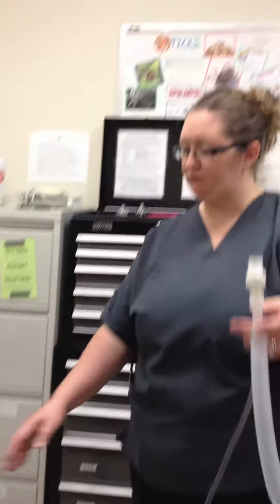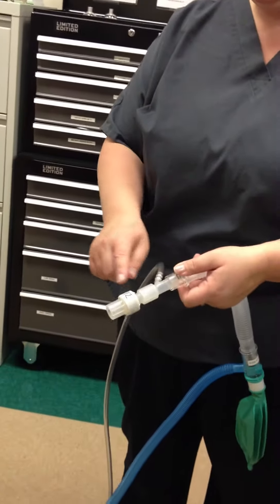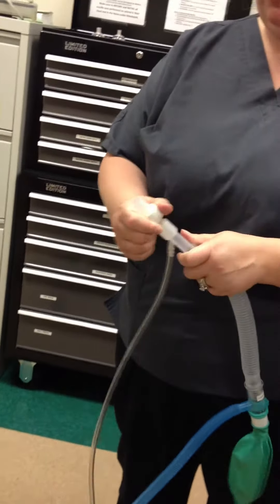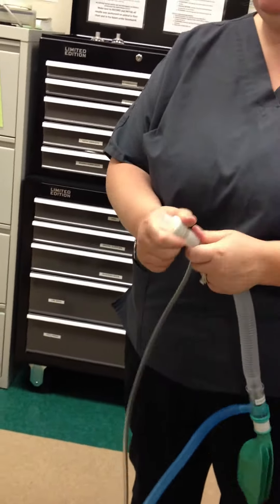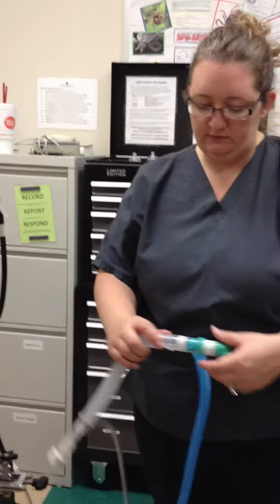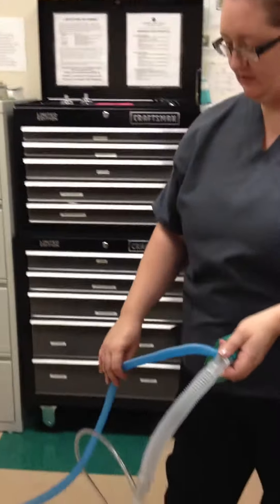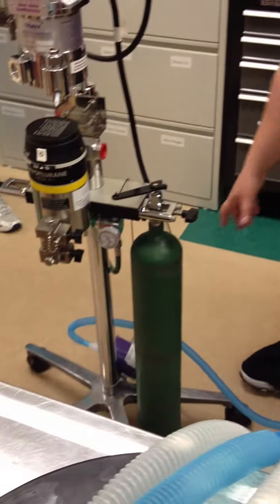Non-rebreather. So it goes from the vaporizer through inhalation tubing. We have a Y-connector on the end here, and then that would go to the ET tube to our patient. Expiratory tubing. We have a reservoir bag here. This is the pop-off valve. You can open and close that to administer breaths to the patient.